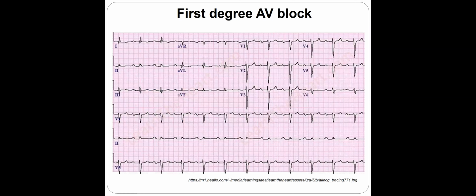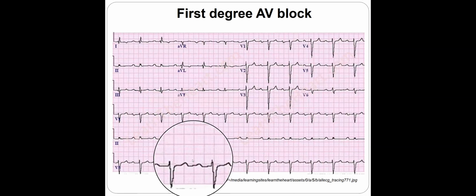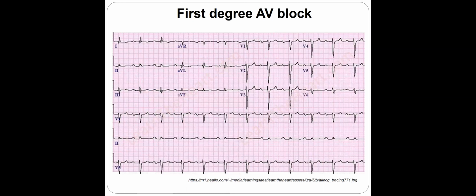This is another graph, okay? Yes, this is rhythmic, very good. We have P wave in front of the QRSs. However, the PR interval is longer. Can anybody tell me the axis on this ECG? What is the main electrical axis? Normal. Well, very good.